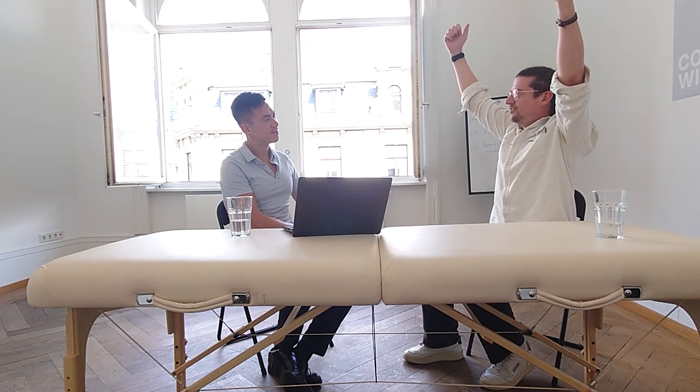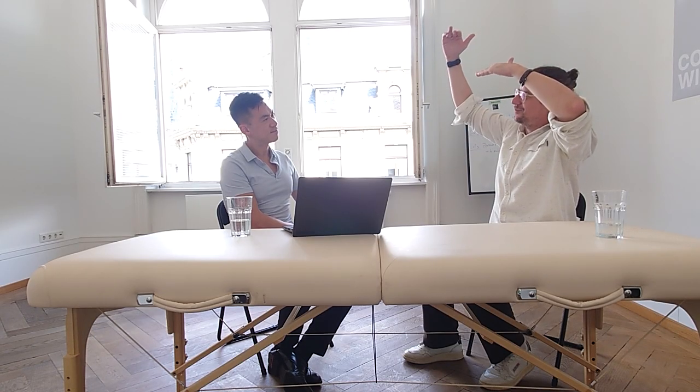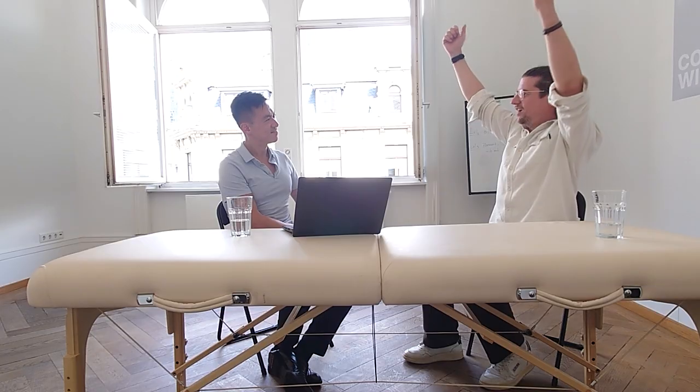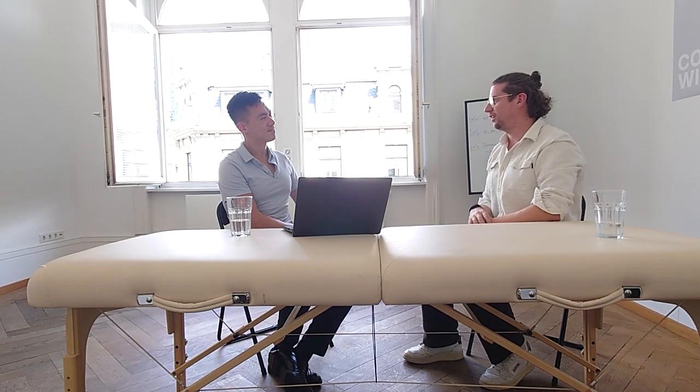So if we put one sensor on the lower trap and one on the biceps, and I tell you I want to see first the lower trap and then the biceps, in many cases that's not the case. And if I say please start first with scapular pull-ups, so you keep your arms straight and focus only on activating the lower trap, is it possible? A lot of people can't do that, and they maybe co-contract with the upper trap. So would you?